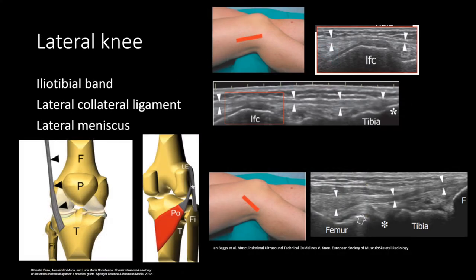For the lateral knee, rotate the patient's leg internally while maintaining 20 to 30 degrees of knee flexion. Follow the iliotibial band on its long axis down to reach Gerdy's tubercle. The arrowheads are the iliotibial band, the asterisk is Gerdy's tubercle, and LFC stands for lateral femoral condyle. Then place the lower edge of the probe on the peroneal head and rotate its upper edge anteriorly until the lateral collateral ligament appears as elongated as possible. Deep to the proximal part of the lateral collateral ligament, you can see the popliteal tendon in its bony groove shown by the empty arrow. Arrowheads show the lateral collateral ligament, and the asterisk shows the lateral meniscus.